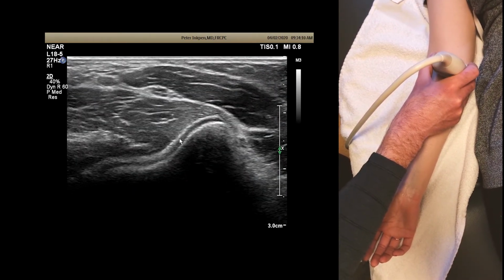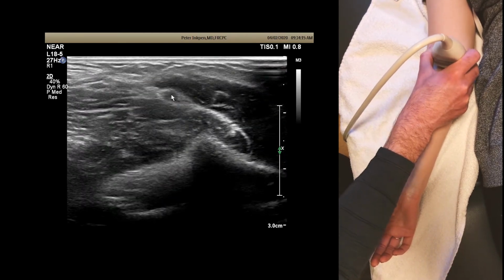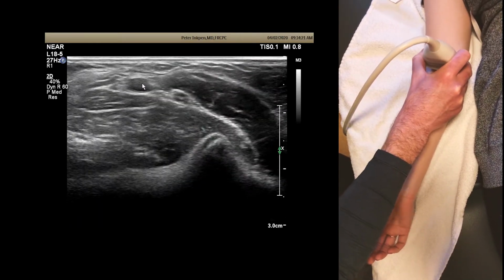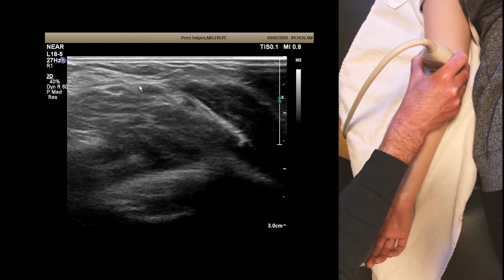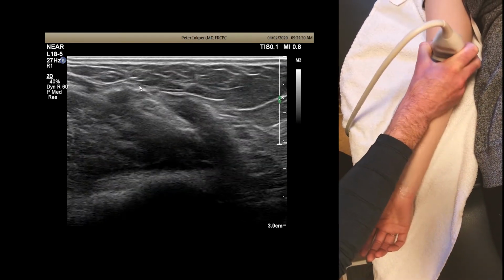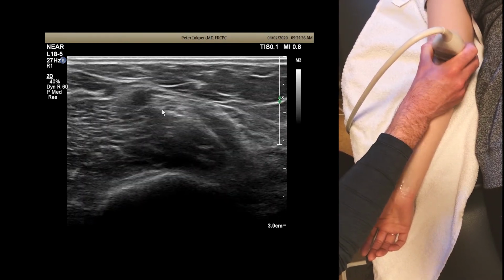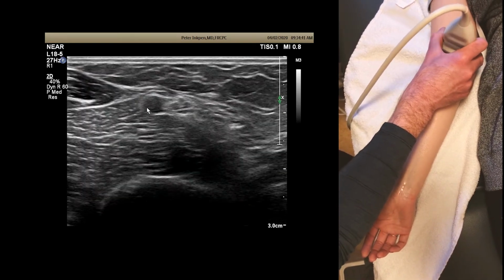Okay, so here's cartilage from the elbow itself. Comes up to here. Now, just on the medial aspect is pronator teres. Here's the brachial artery. Bring my focus up a little bit. I'm running out of ultrasound gel. Median nerve. This is the beginning of pronator teres. Here is the median nerve proper and the brachial artery.